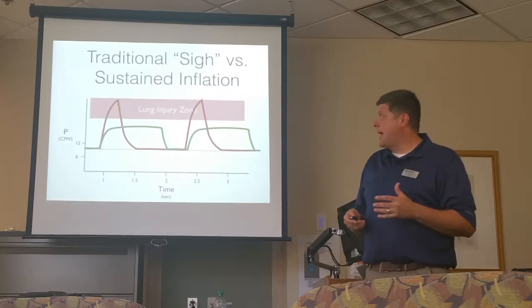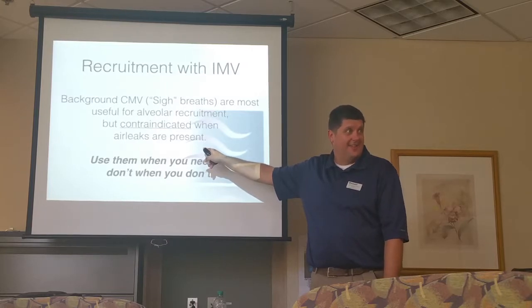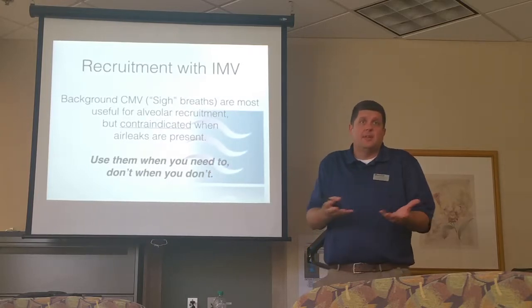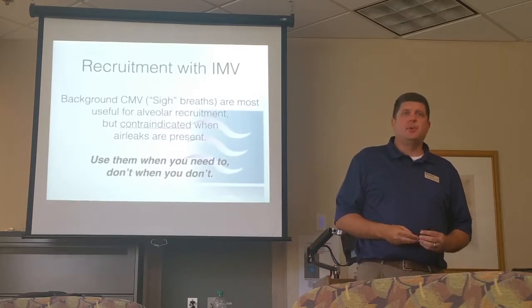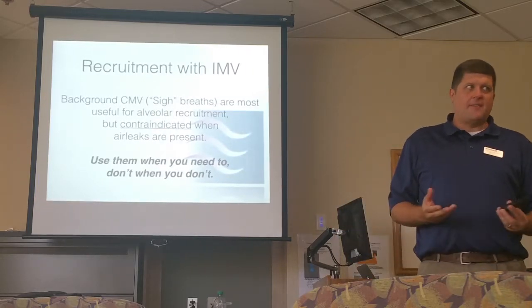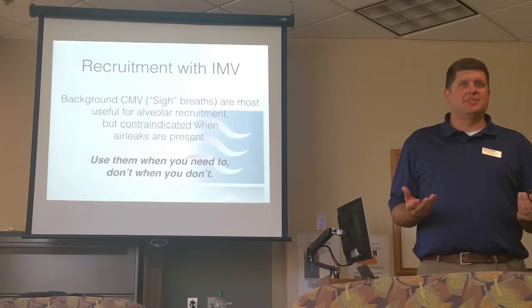Because those background breaths are great for recruiting the lung, but they're bad for lung injury, right? They're bad for air leaks, and if we use and abuse them too much, then we're not doing the baby any good, okay? The rule of thumb that I go by is use them when you need to and don't when you don't. If lung volume looks good and you don't have atelectasis, then we don't necessarily need to be on a backup rate. Ideally I would like CPAP for those types of patients.